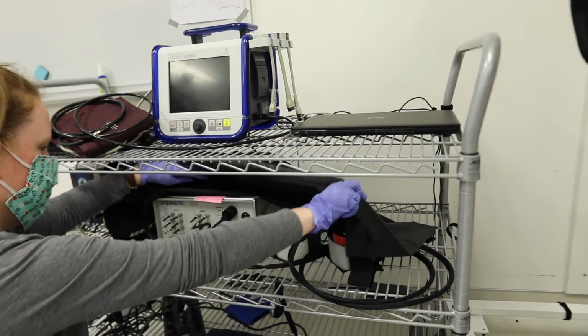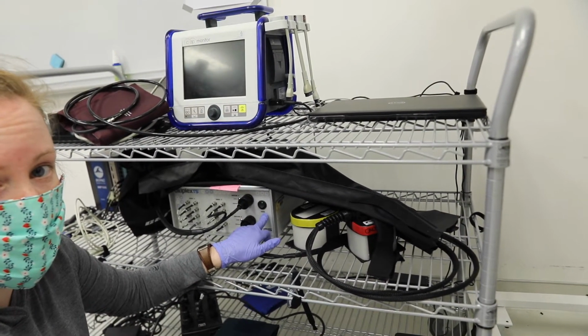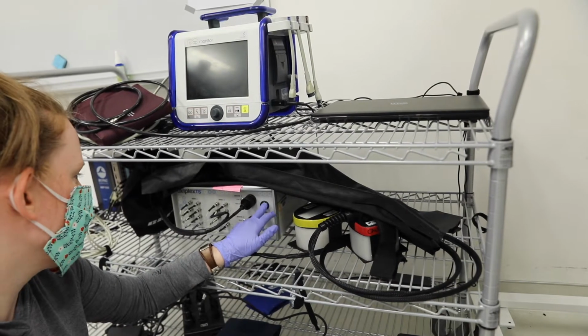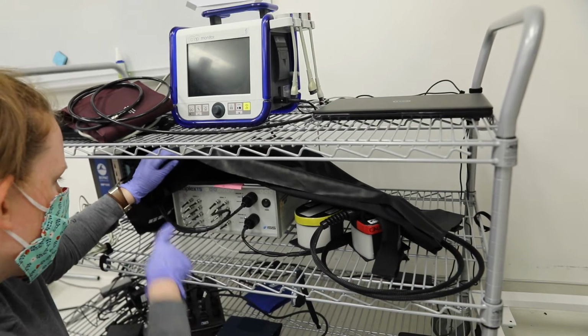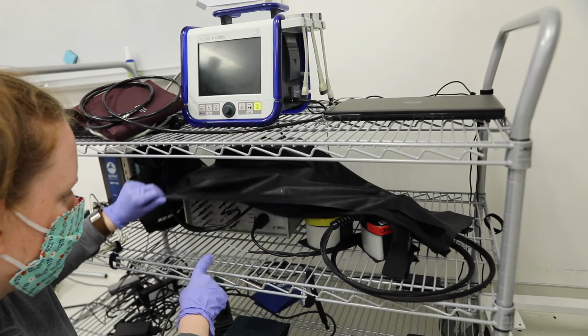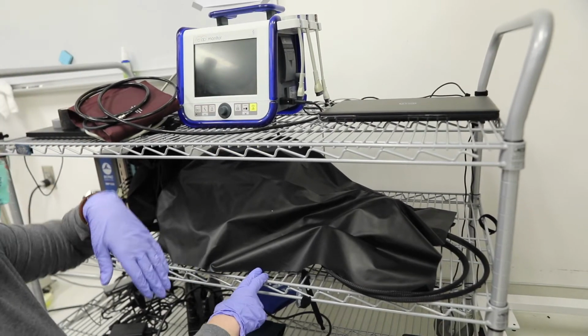But to finish getting the NIRS ready, we're going to come down here, and this is our NIRS machine. We want to make sure that it's on for at least 15 minutes before we calibrate it. You can tell it's on when the green light is on above the power. We want to make sure to keep all these little wires covered in the black tarp, because they're really sensitive to light and it can screw things up.